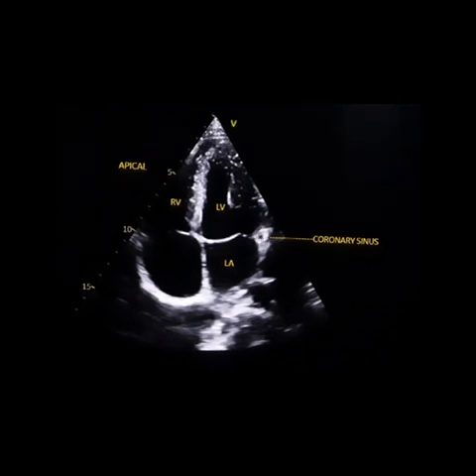Here is nothing, so it is difficult to say whether this is a coronary sinus, a venous system, or coronary artery. Circumflex coronary artery also may look like this. So you can always look into this. When it is dilated, you will be able to see a big coronary sinus here.